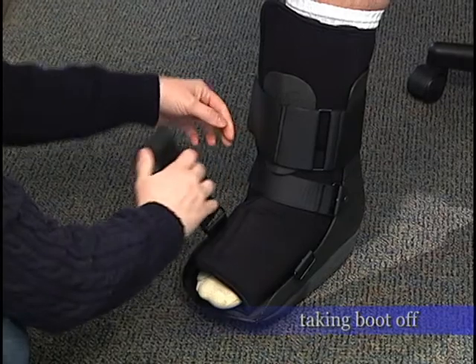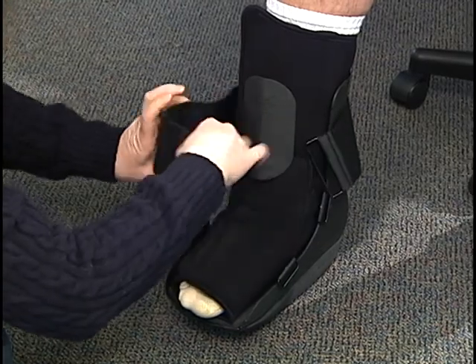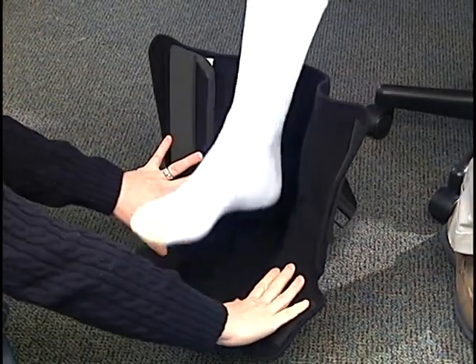Un-Velcro your straps back on themselves one at a time. Remove the Velcro all the way down and carefully remove your foot.